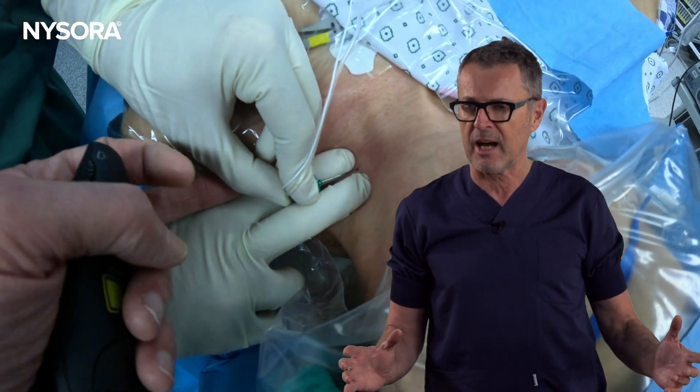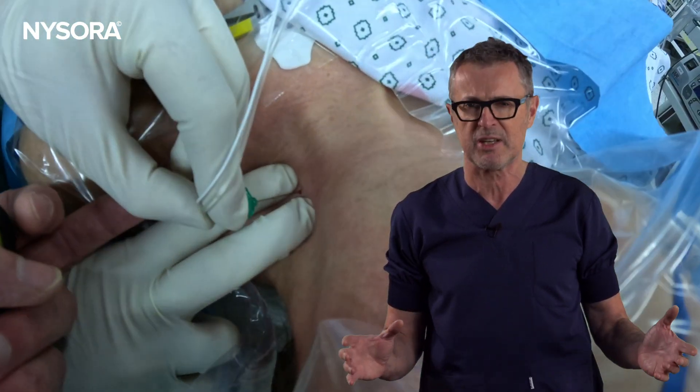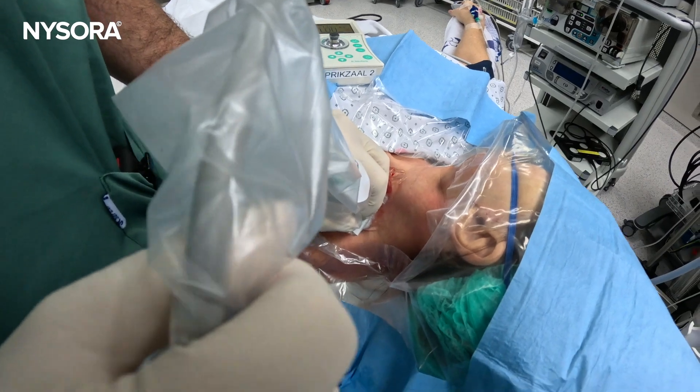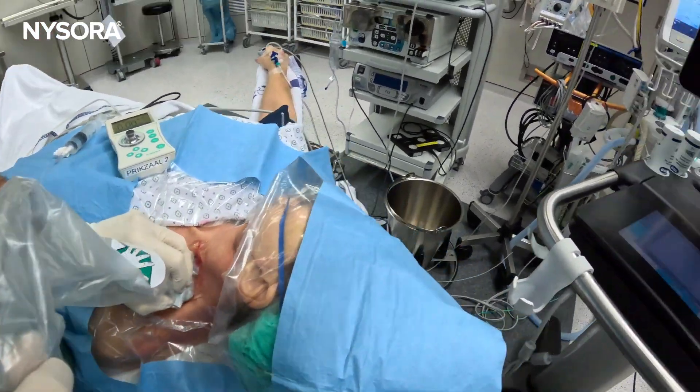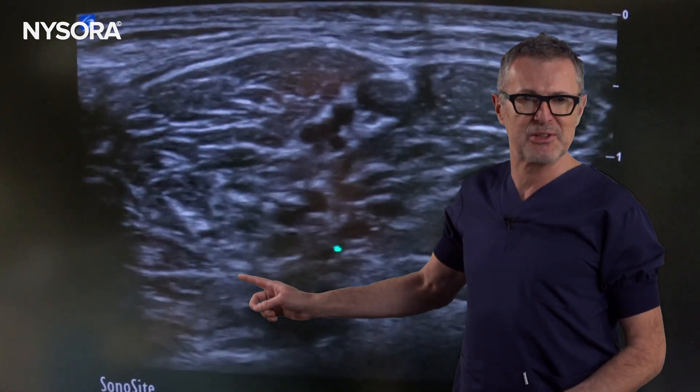Would a nerve stimulator guided block without the visual aid of ultrasound be successful? And as it usually goes, just as we finished, an ultrasound machine was brought in. We took a quick look at the distribution of the local anesthetic, and what we found was surprising. Watch this video to the end to see the results for yourself.